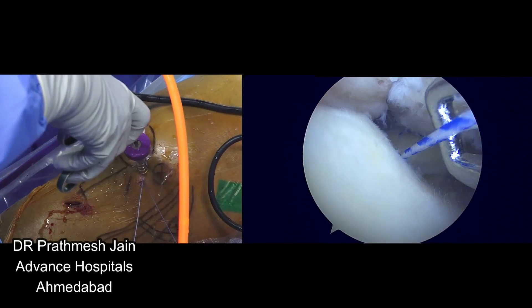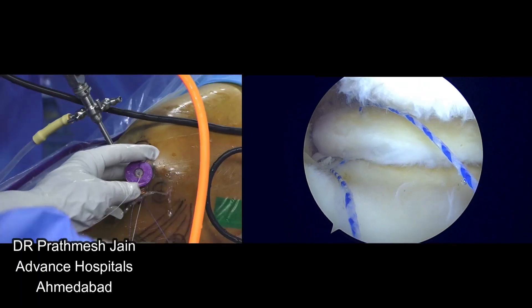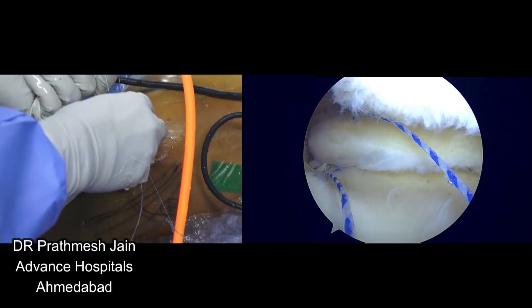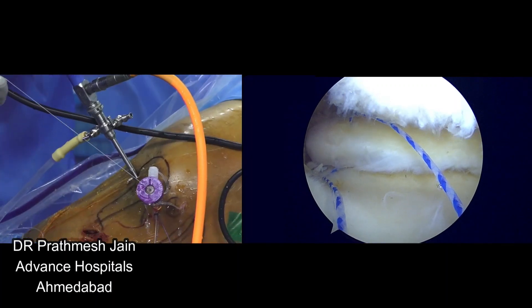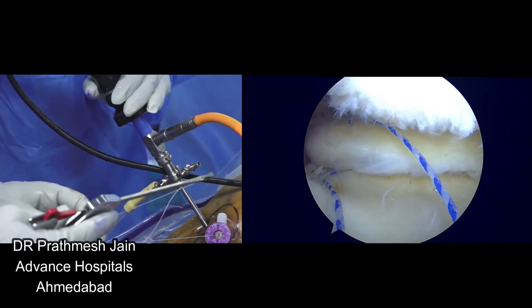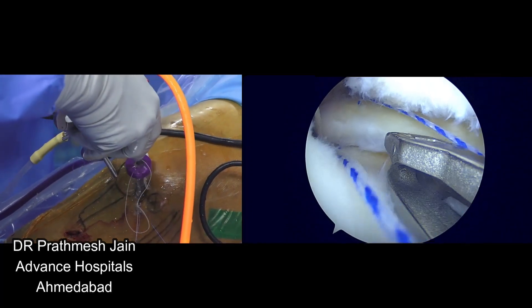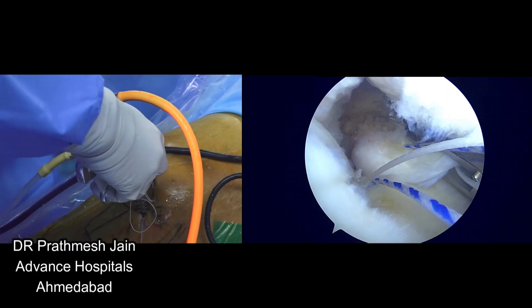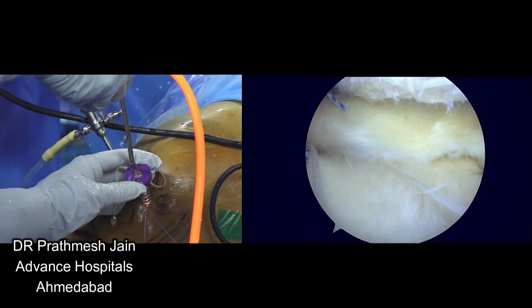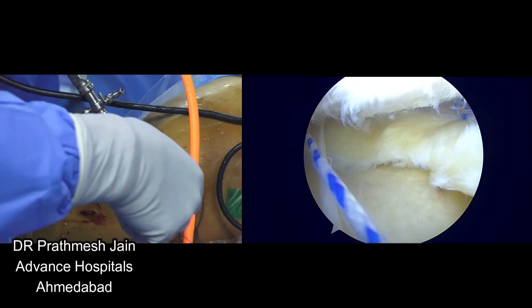What I am planning to do is a Mason Allen repair. I have passed my first blue suture and now I will be passing my white suture into its place. A Mason Allen suture pattern means you need to pass three suture limbs through the meniscus. The first suture limb we passed is the blue one, and the second limb we have passed is the white suture limb.